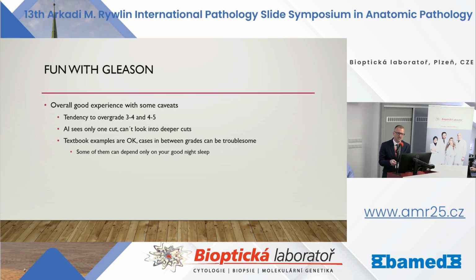And sometimes it's a bit of a mystery how it was really trained, what it understands as cancer, because it really depends upon contrast, color and so on, that's translated into zeros and ones.